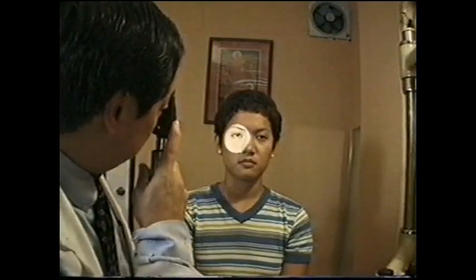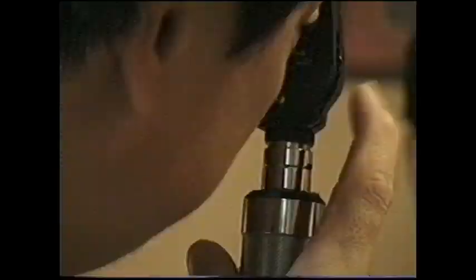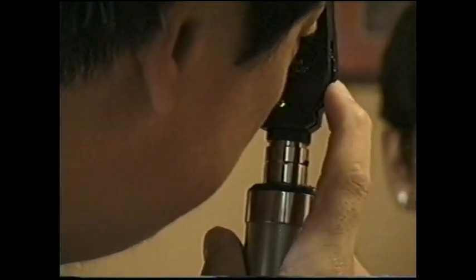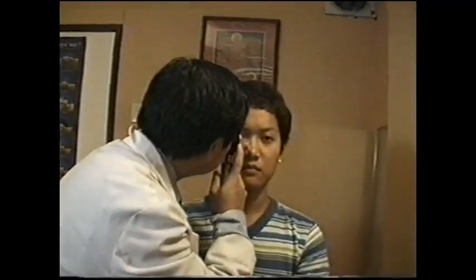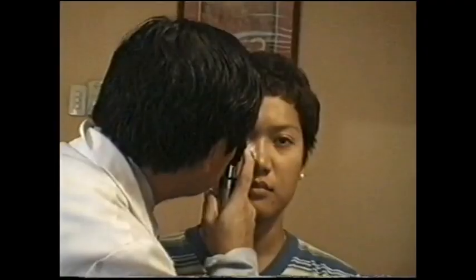The red-orange reflex is checked from a distance, after which the examiner slowly approaches the patient. The ophthalmoscope is focused by shifting the dial until a clear image of the fundus is obtained. The patient's optic disc is examined first to assess the cup-disc ratio. The optic disc is followed outwards to examine the superinasal, superotemporal, inferonasal, and inferotemporal areas.